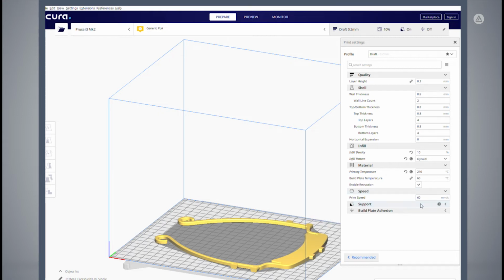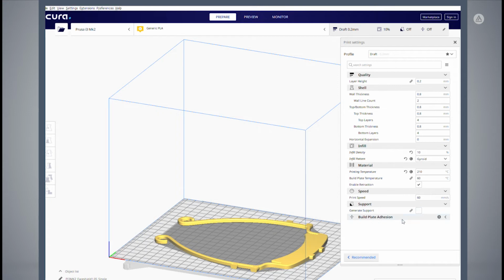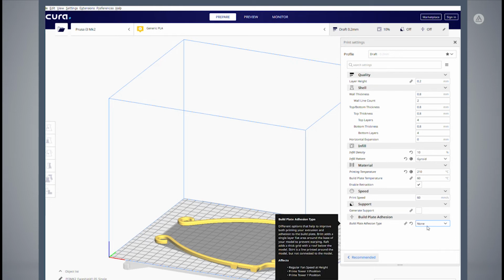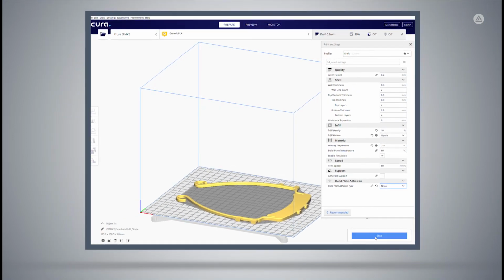Next, we'll turn support off. This model is designed to not need any support, and we don't want to add time cleaning the models at the end. Lastly, we'll look at build plate adhesion. We can use either skirt or choose none at all. This design works without a brim or a raft, which will prevent a ragged edge from scratching the wearer's forehead. Go ahead and apply these settings to your part by clicking on the slice button, then export the part for print by clicking File, Export.